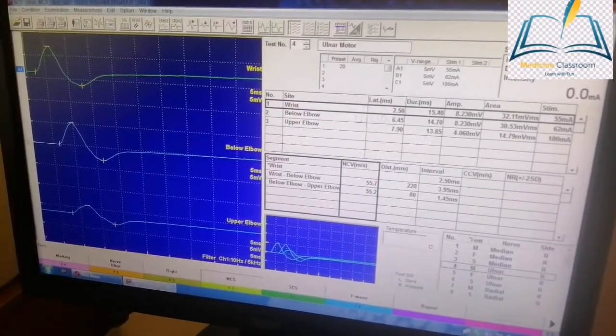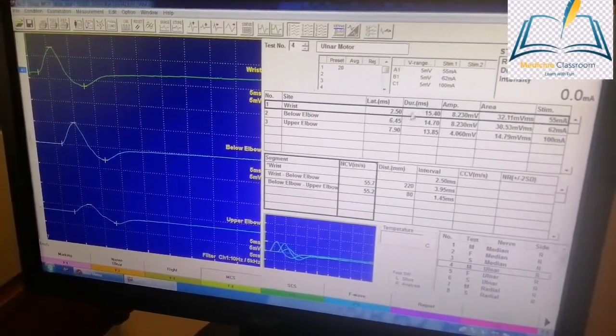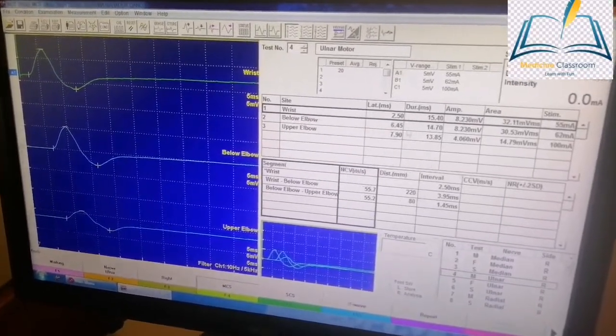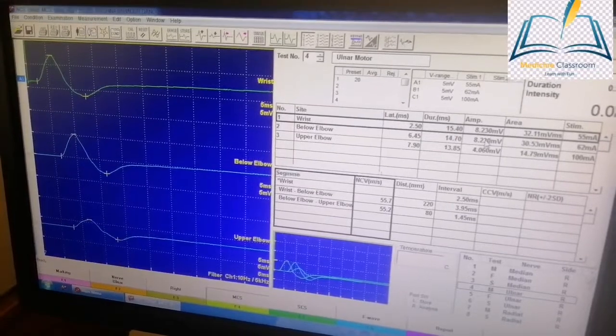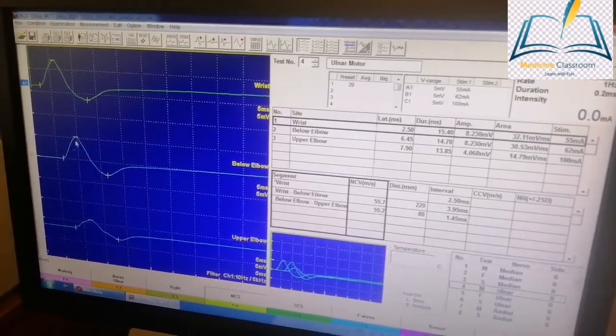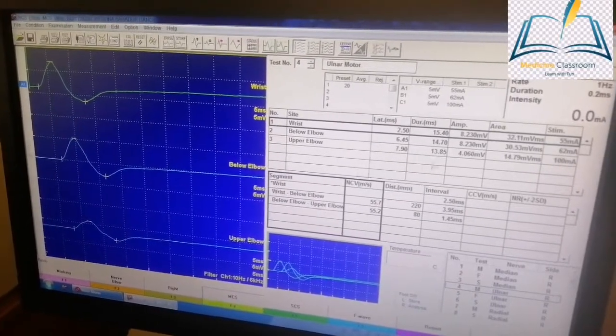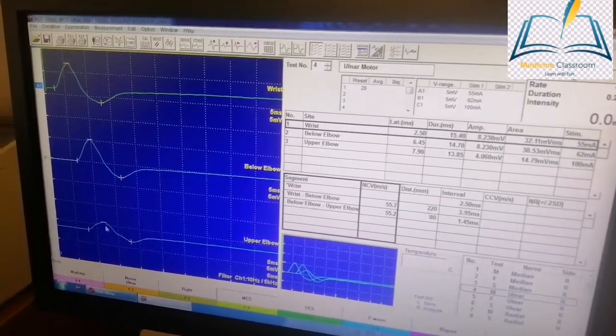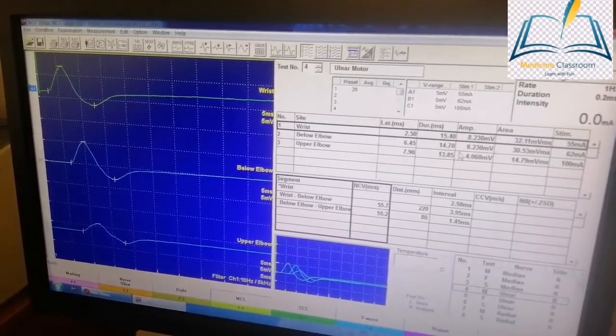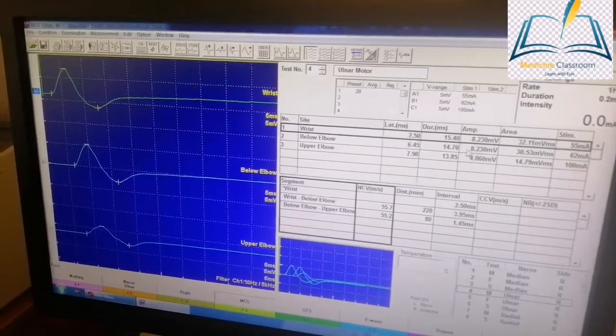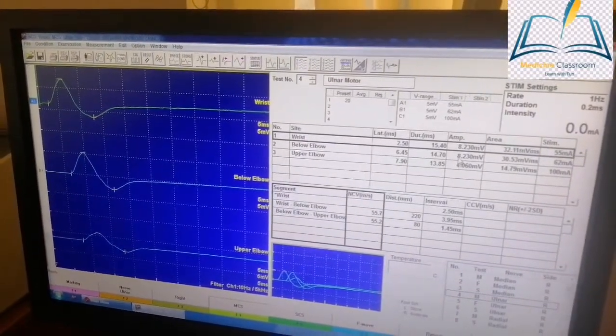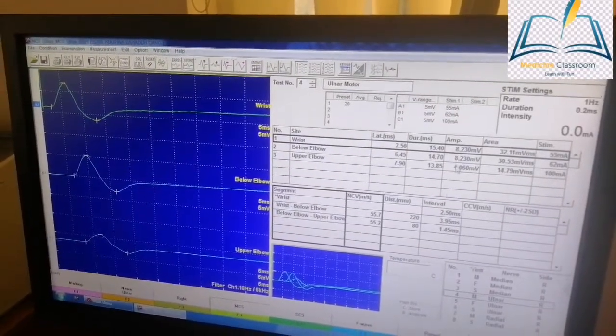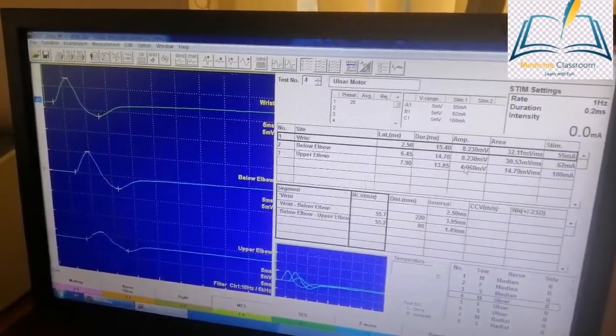But if you compare the motor unit action potential amplitude from the wrist, below elbow, and upper elbow: in the below elbow you can see the amplitude is 8.23, but in the upper elbow this amplitude is only 4.06. If you take out the ratio of the proximal and the distal stimulus amplitude, you can see there is a significant drop in the amplitude.